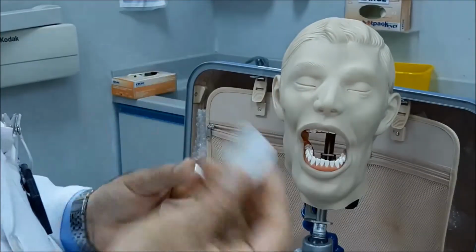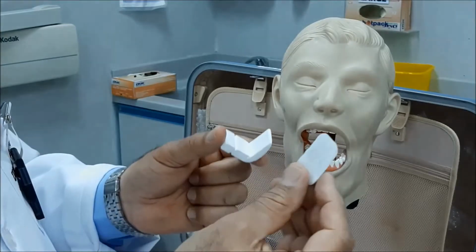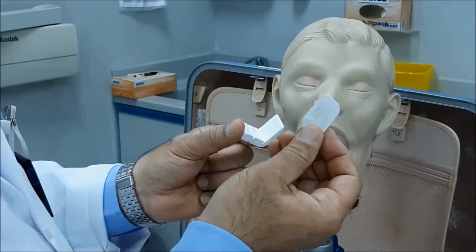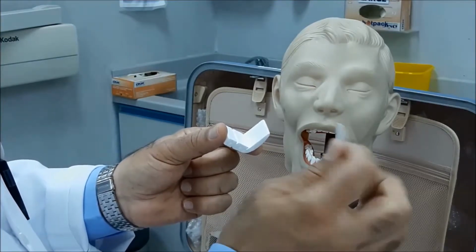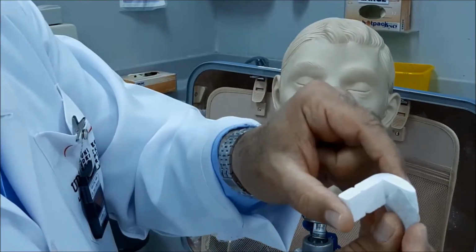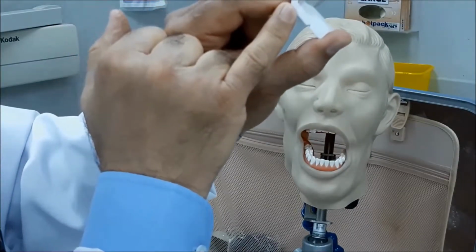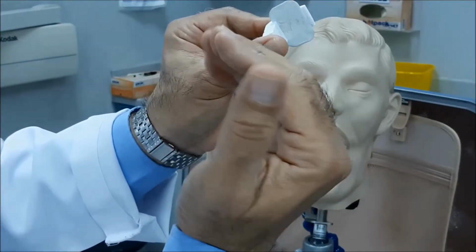So what you do is that after you receive the sensor from the nurse, of course it is wrapped in the disposable cover. You go, and I'm going to use again for purposes of demonstration, the regular film, the analog film, which is very much similar in terms of thickness. So you're going to slide the sensor into this slot all the way down, okay? So either side will fit, as I said earlier.